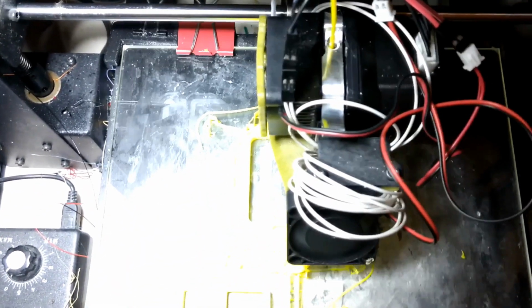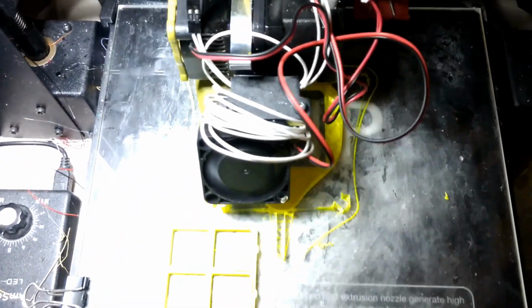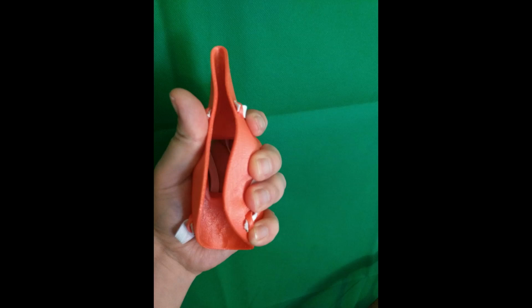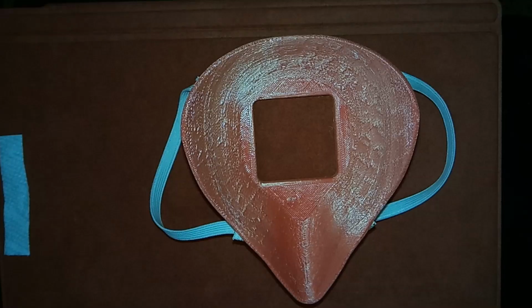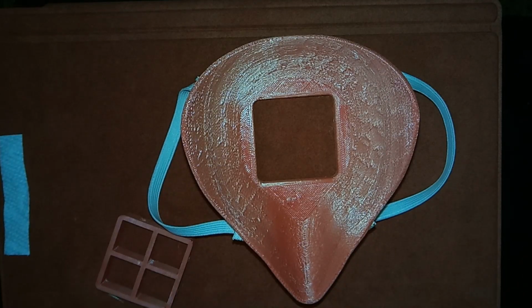Now, why use TPU? Well, the best thing about TPU is it is flexible. So you can squish it like this and it pops right back open, just like that. So it'll conform to your face very easily, enough so that you can actually suction onto your face just using the mask itself.